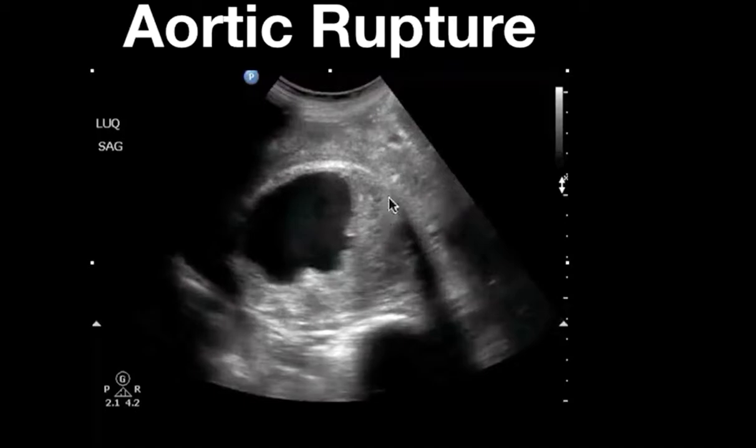In this sagittal video of the same patient, again, note the presence of retroperitoneal hemorrhage anterior to the aorta. But again, note that this echogenic fluid could be very difficult to identify. So you get the idea that the poor sensitivity of ultrasound in detecting retroperitoneal hemorrhage has been well described.